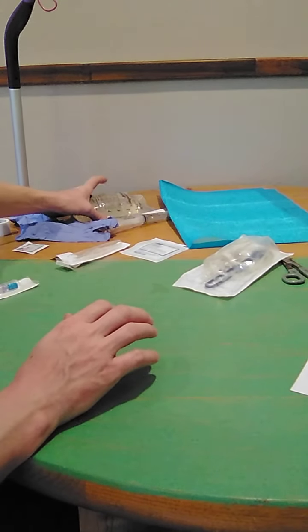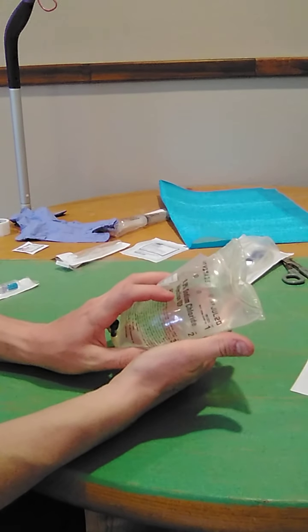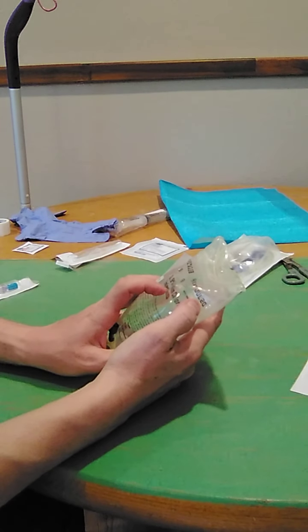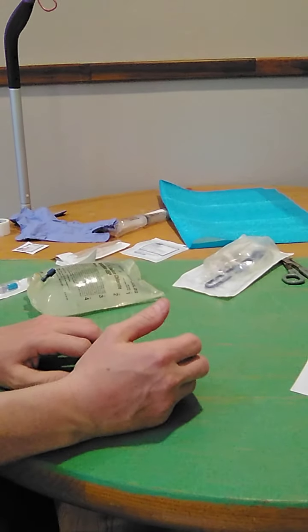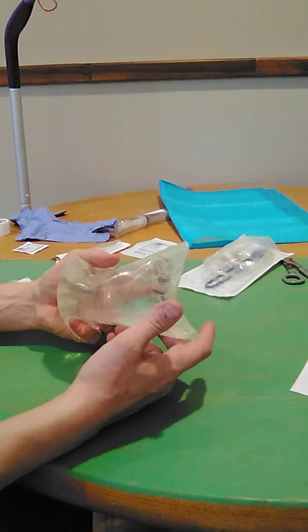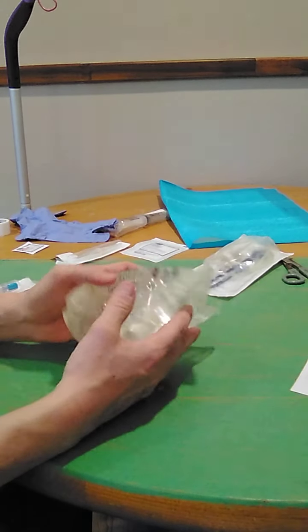and that the order is written for 500 milliliters of 0.9% sodium chloride injection USP, and that the expiration is July of 2020, so that is not expired yet. So I have that is correct. I'm going to check this bag for particulates, any defects, its expiration date, which I already have, and any discoloration.